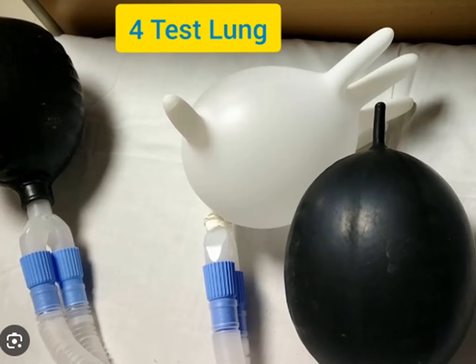So like you use for mask ventilation, when you squeeze the bag, you just put one on the end of the circle system, and you can see there someone's even taken a glove and put it on the end, and you can test the ventilator with a non-sterile glove on the end of the circuit. And basically, if you stick that thing on the end of the circle system, you dial up your gas flows, you can put the ventilator into a mandatory mode, and it will just ventilate that bag as if it's a patient.